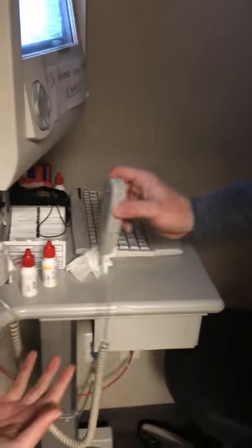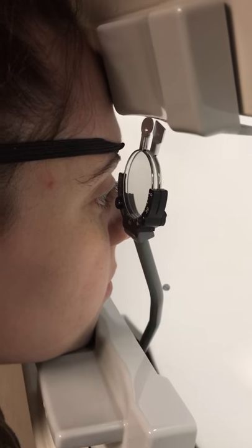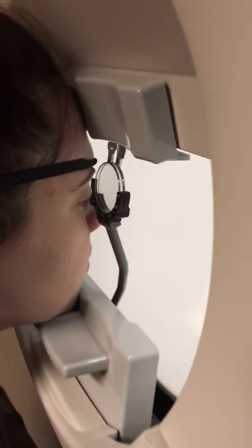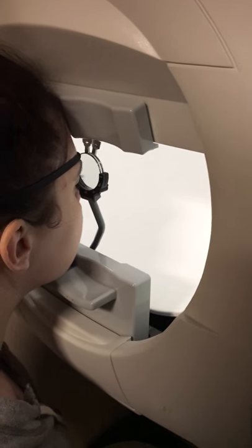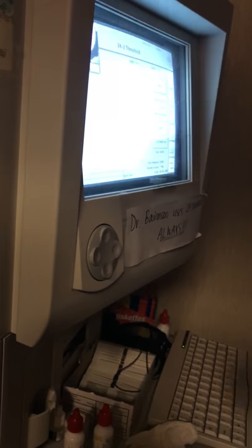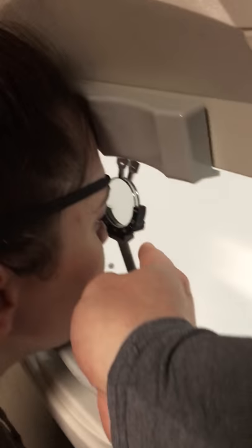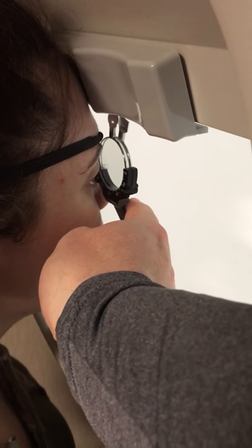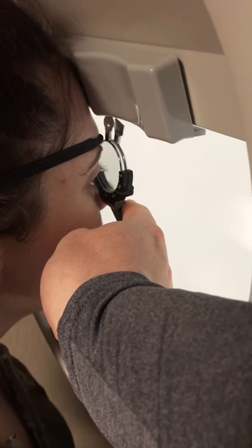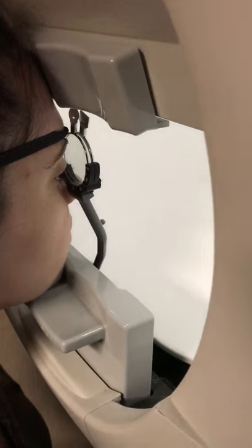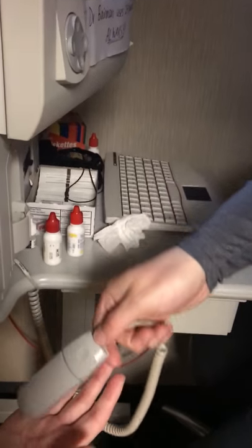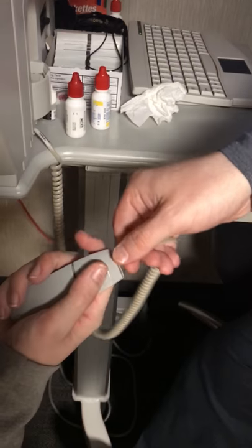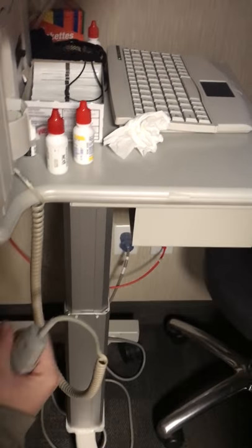Before I give her this clicker, I want to make sure that this lens is close to the eye. If the lens is too far from the eye, you'll get what's called a rim defect, an artifact. When the lights flash in the background, they're going to miss those lights where that rim is. You want to bring this very close to the eye, just before their lashes. Then we'll give her this clicker that she'll be clicking during the exam.